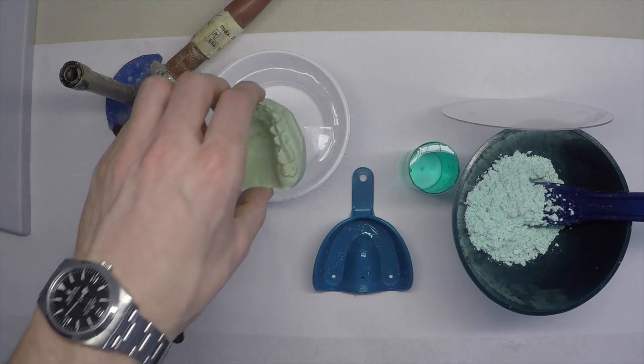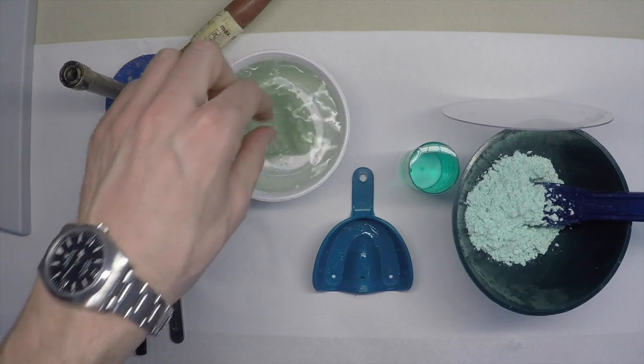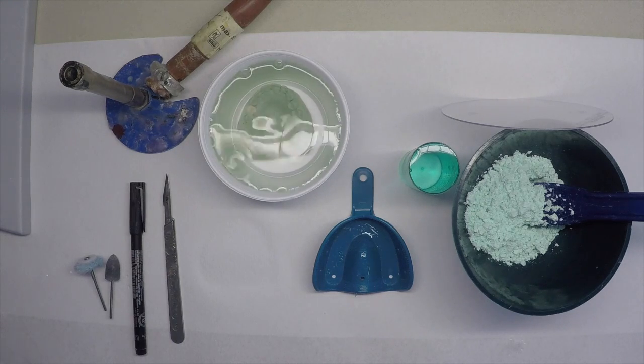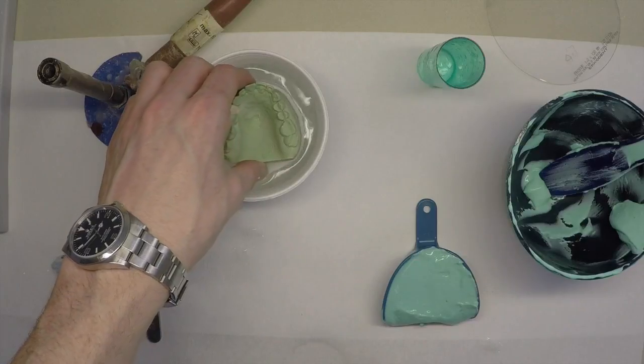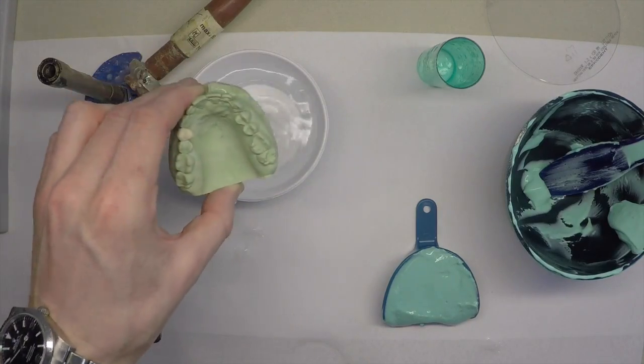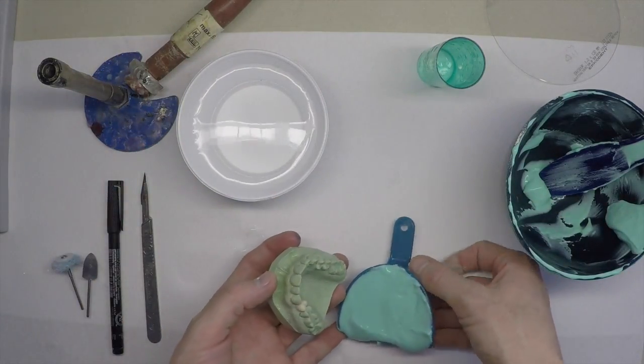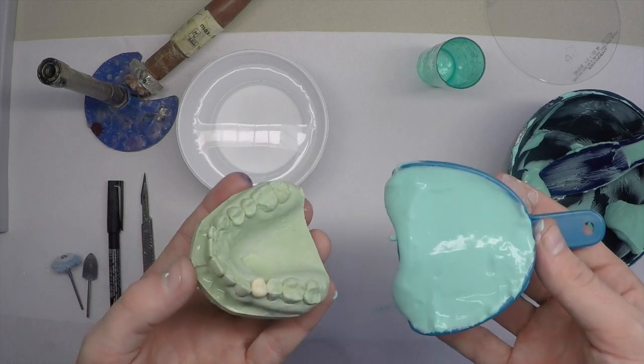First things first, we'll pop the model into the slurry water so the alginate impression doesn't stick to the stone. Once the stone has soaked for 5 minutes, we'll take an alginate impression of our model.